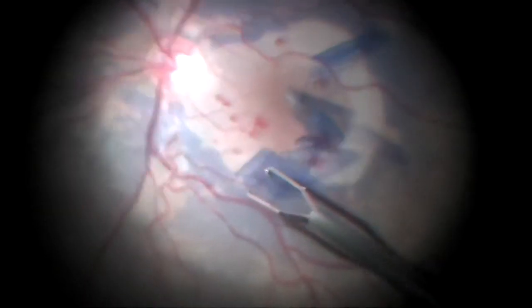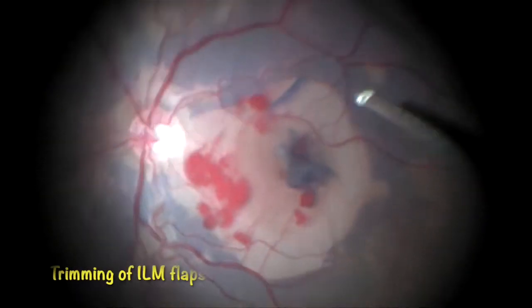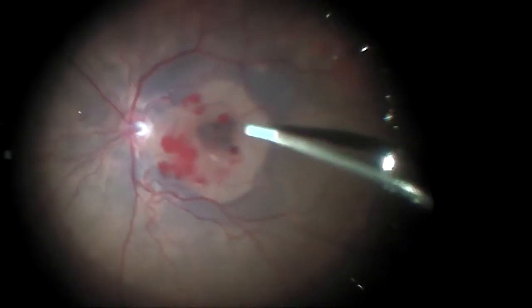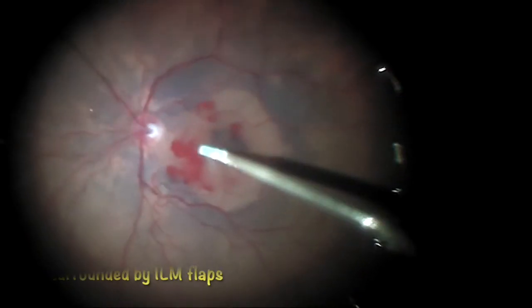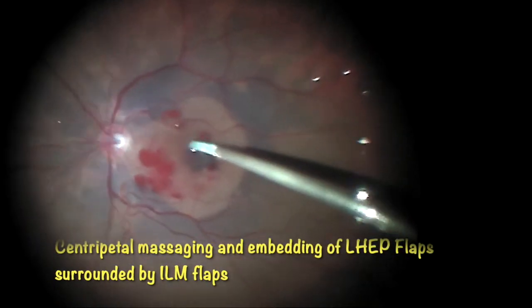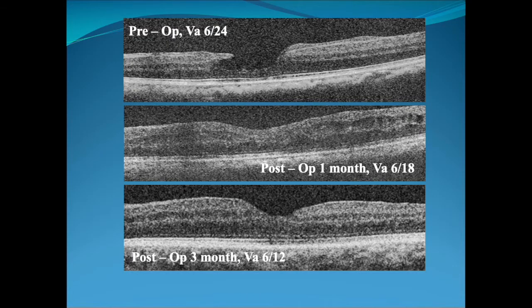The basic principle of this technique is to embed the Muller cell-rich LHEP tissue back into the lamellar macular hole defect, as the origin of LHEP is from the inner retina, and thus the Muller cells produce growth and trophic factors to close the defect. We can see in this case a good recovery of foveal contour and functional outcome.